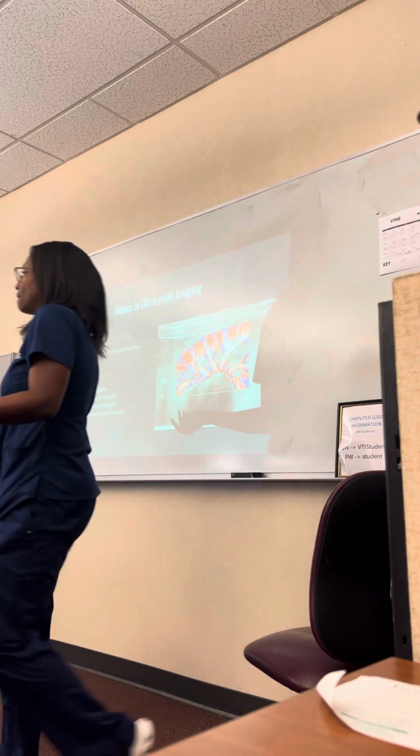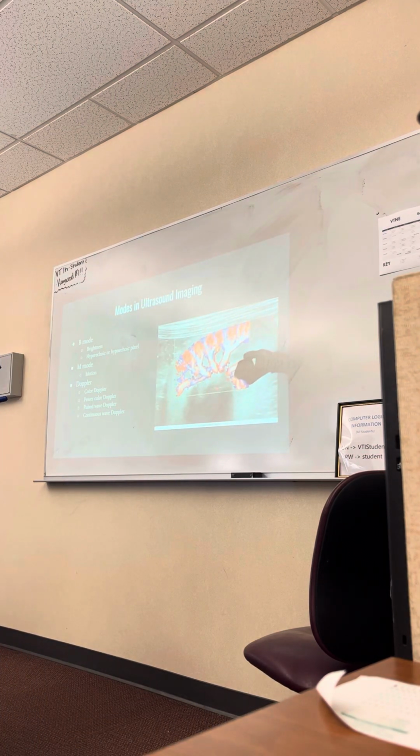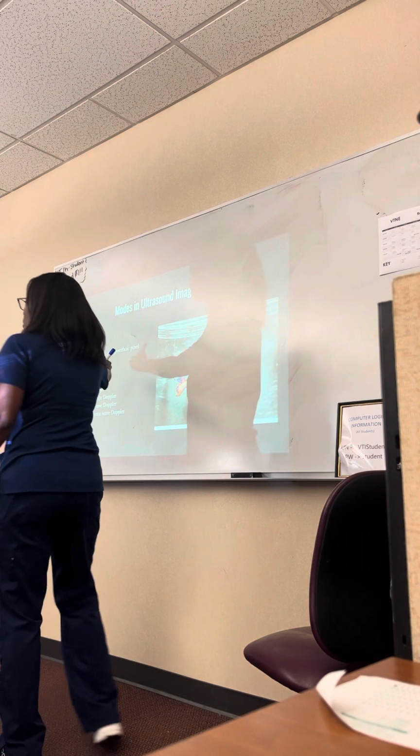What areas would you use B mode in? For your tissue. So ultrasound can be used for all soft tissue. All soft tissue is for ultrasound overall. When you're starting to want to see certain things is when you're going to change your mode.